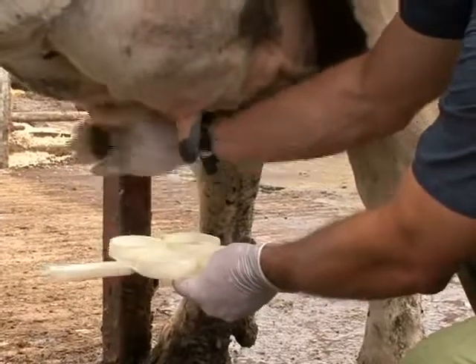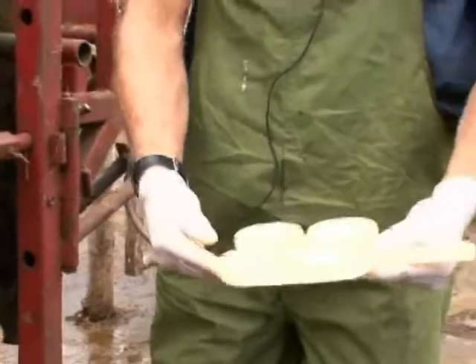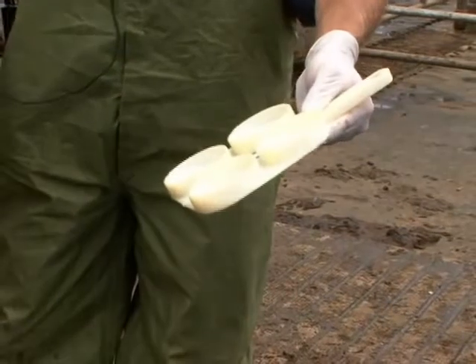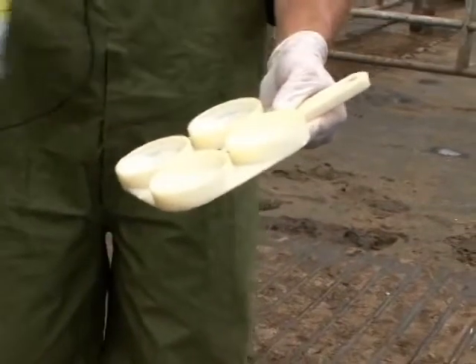Once we're finished adding enough milk, we tilt this device over to the side to make sure we have an equal amount of milk in each well, and it looks like we have an equal amount of milk in each well.